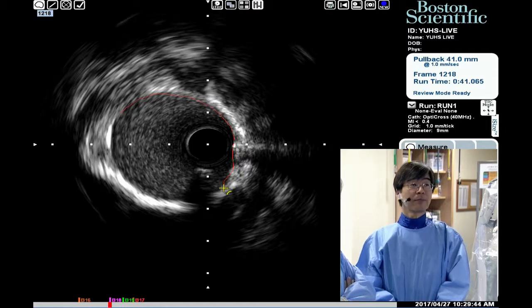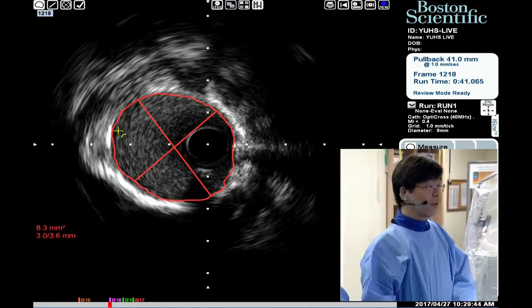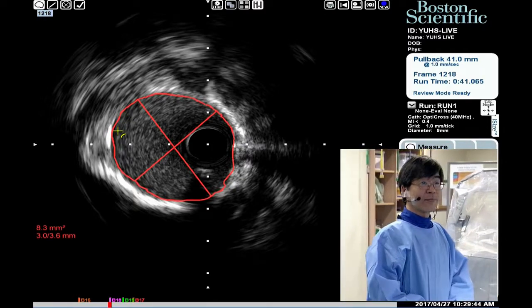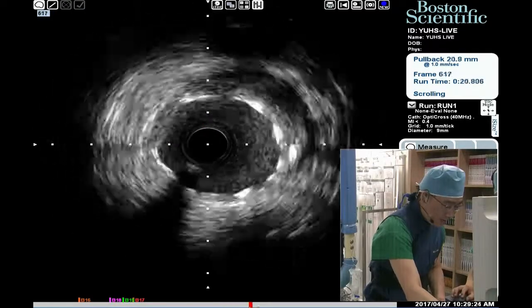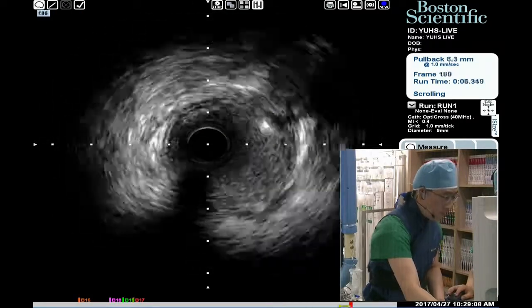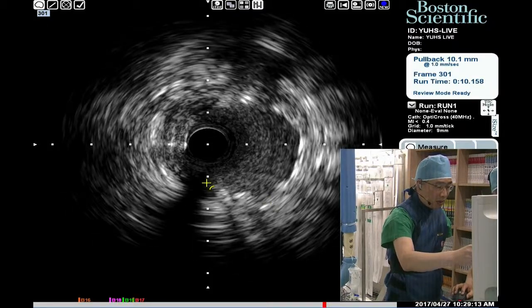The distal part of the stent looks like it is a little bit underdilated. Professor Kim, what is your opinion? Not the distal part, just the distal edge of the stent. Tell me the area of the distal margin of the stent and the smallest lumen area at the left main. Let me check again, the distal part. Okay, distal edge.